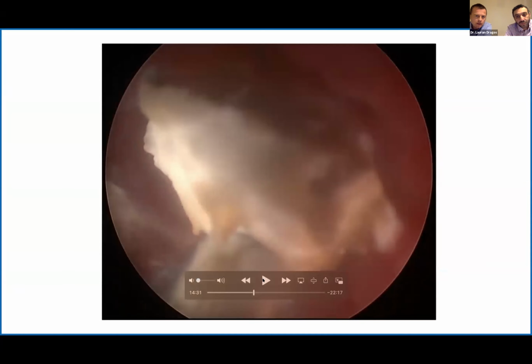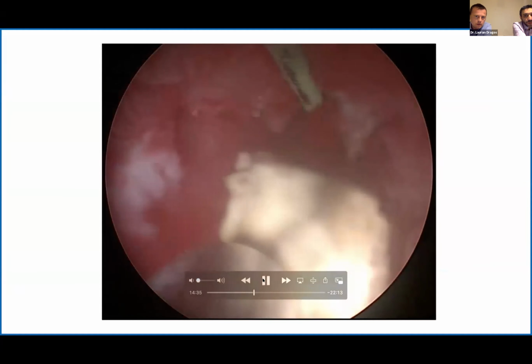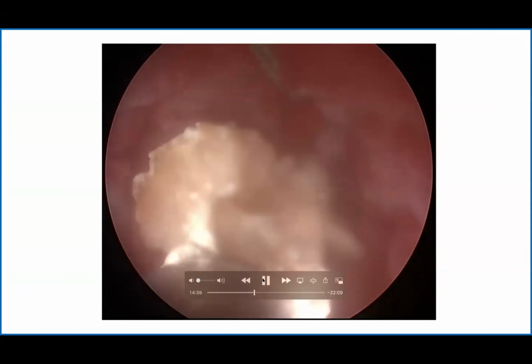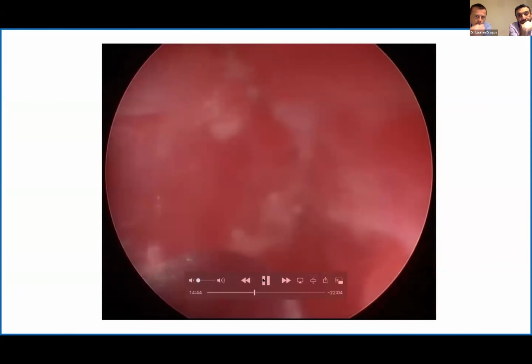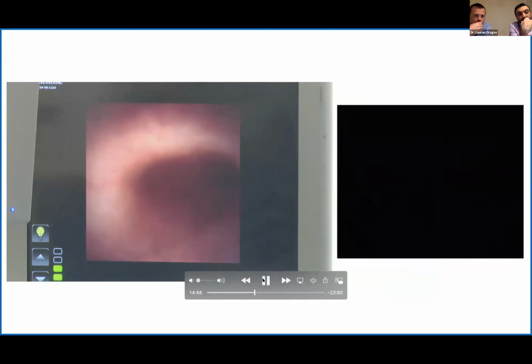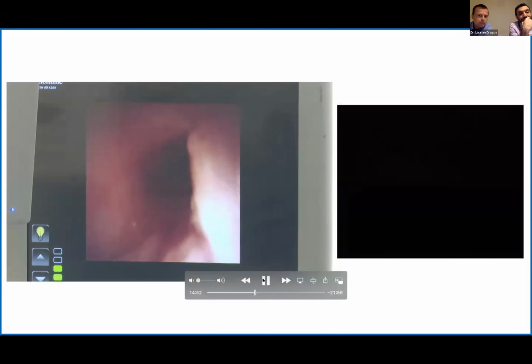And your impact is down, is it, to try and stop the stones from moving away from you? Exactly. Yeah. When you push them, you'll see that given the access, most of the stones tend to go down to the PUJ area. So obviously my scope is there, but I'm trying to stay away from the nephroscope and from the Trilogy probe. Yeah, yeah.